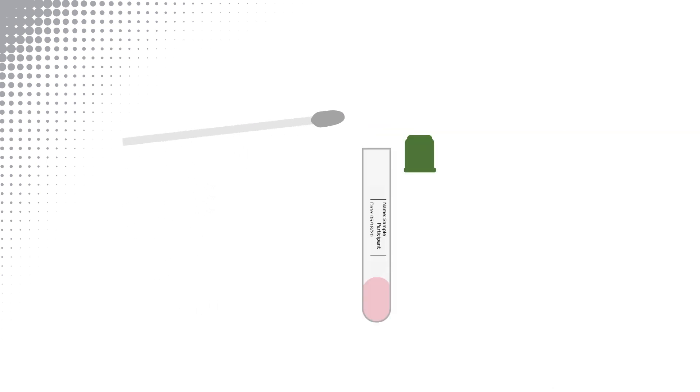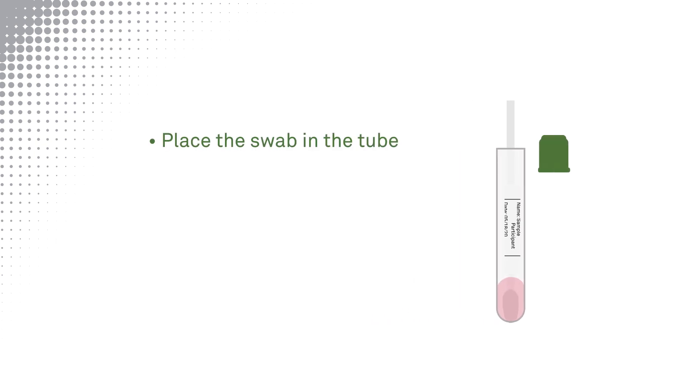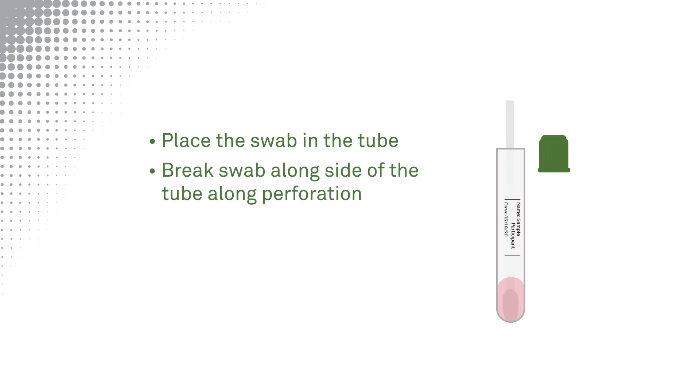Insert the swab into the tube, tip first, until it reaches the bottom. The tip of the swab will be in the liquid. Break the swab handle against the side of the tube at the perforated break point.